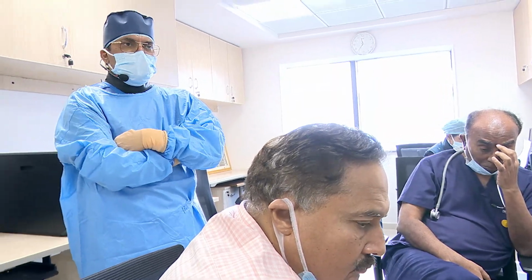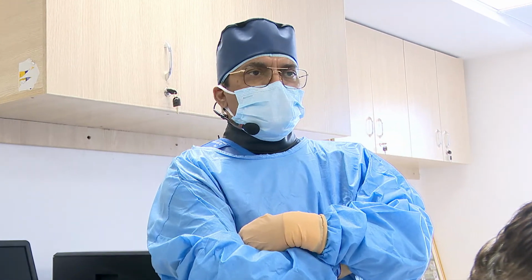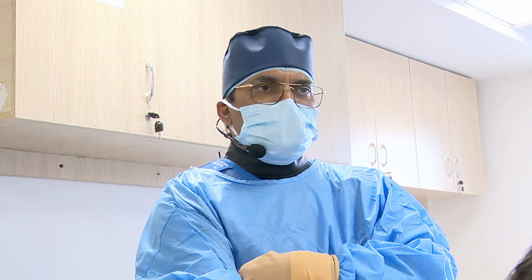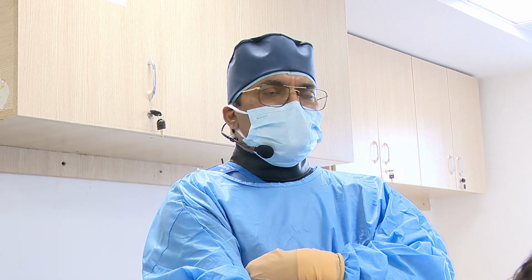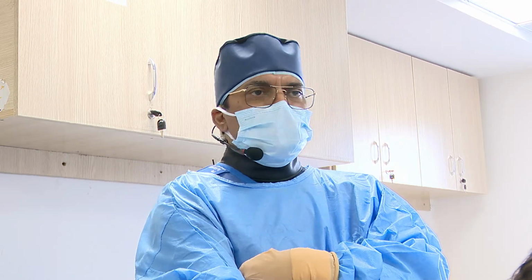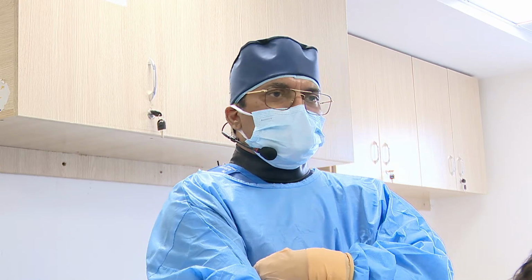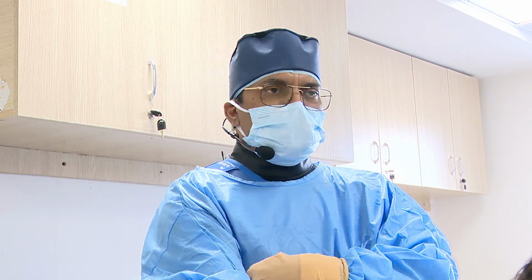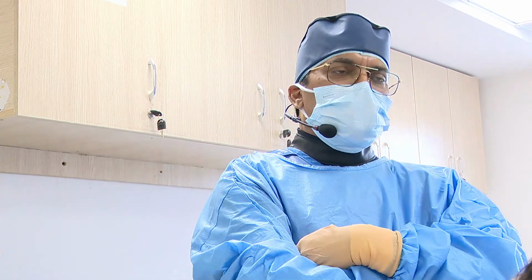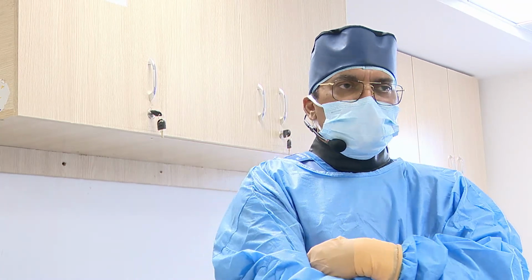After the plaque modification, we will assess the distal landing zone and lesion length, and choose the stent size according to the imaging. We will plan the provisional stenting with imaging. Once we do the provisional stenting, we will optimize with an NC balloon. Once the implantation is completed, we will see the side branch flow. If anything is there, we will decide whether kissing balloon is required or not, to go ahead with that.